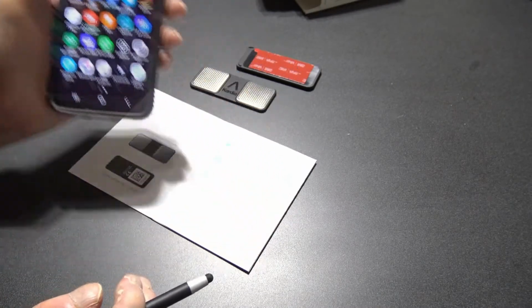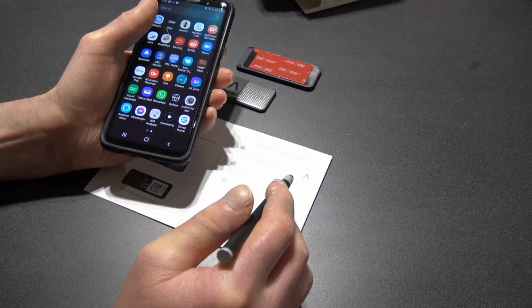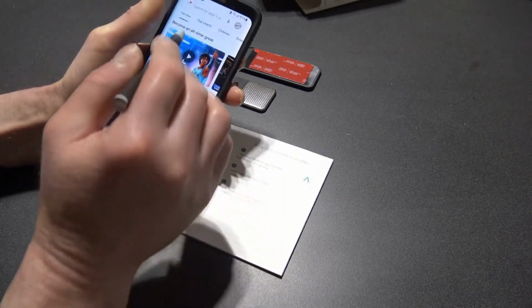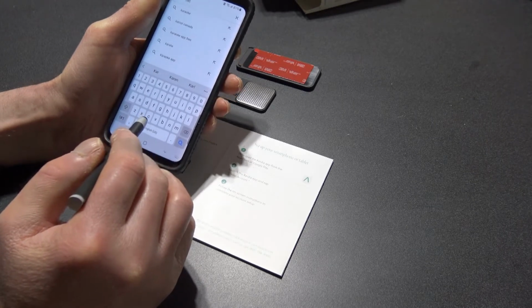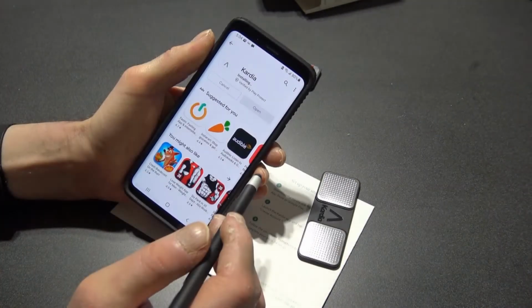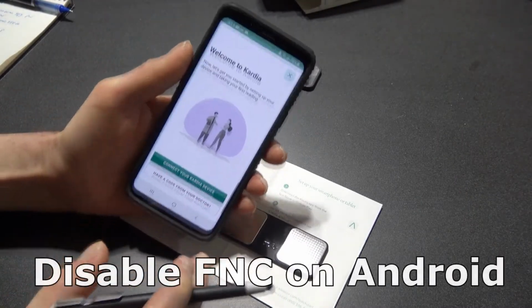All right, let's install the software. In the instructions, it says here, download the Kardia app from the App Store or Google Play. So I'll go to Google Play. What I'm going to do is create my account, and then I'll be back and show you how to finish the setup. Okay, now that my account's created, let's go ahead and set this baby up.